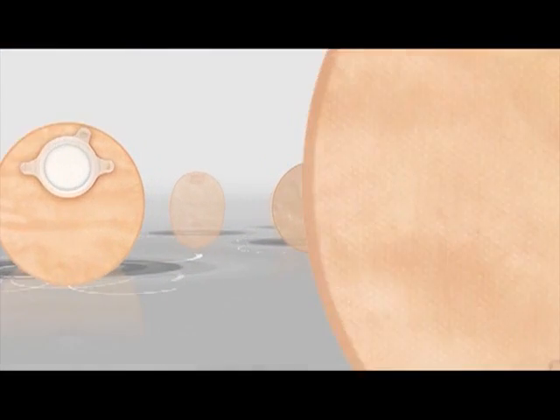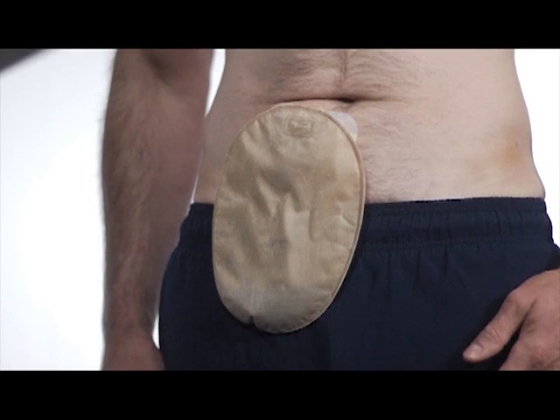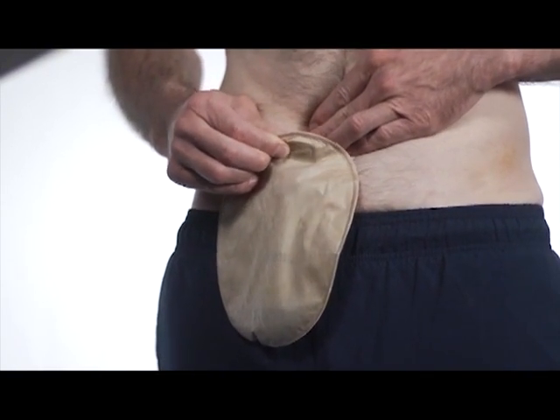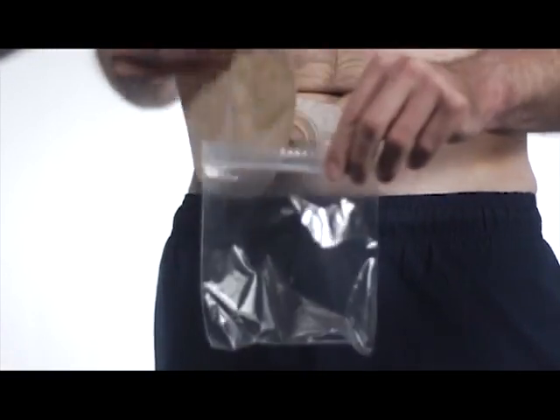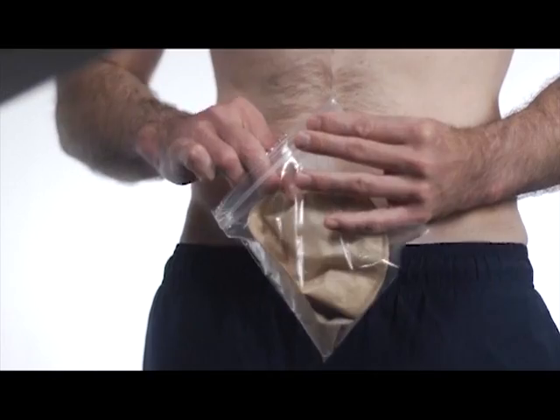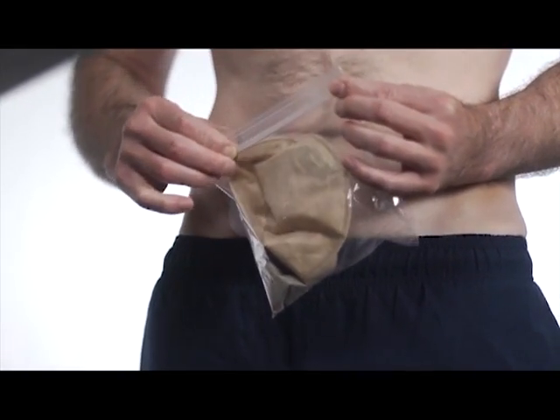Closed-end pouches are designed to be one-time use only and disposable. When the pouch is 1/3 to 1/2 full, remove the pouch by grasping the top tab of the flange with one hand while holding the skin barrier against your body with your other hand. Gently peel the pouch from the wafer. Discard the pouch. You may want to use a plastic bag with a zip closure for disposal. Apply a new pouch and make sure to wash your hands.